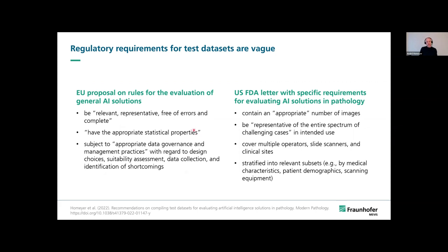Also in 2021, the FDA defined specific requirements for evaluating AI solutions in pathology in a letter related to the first approval of a commercial product. And the FDA is a little bit more specific, but not much. It requires test datasets to contain an appropriate number of images, whatever appropriate means.